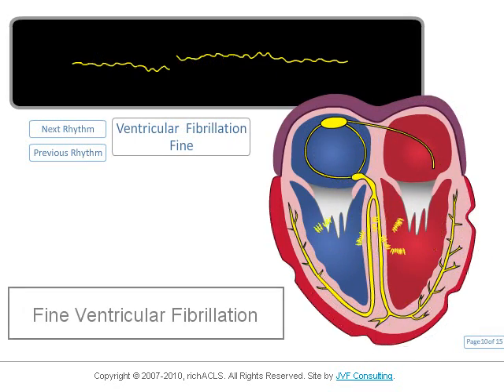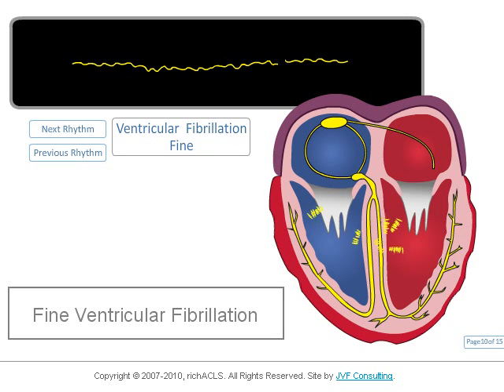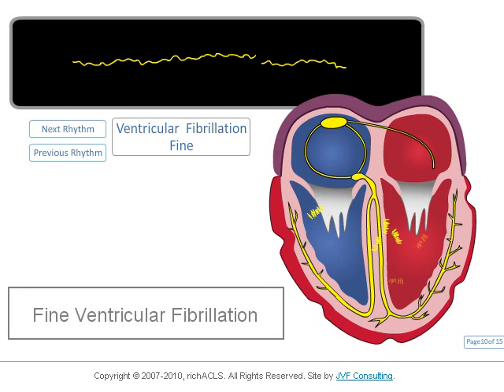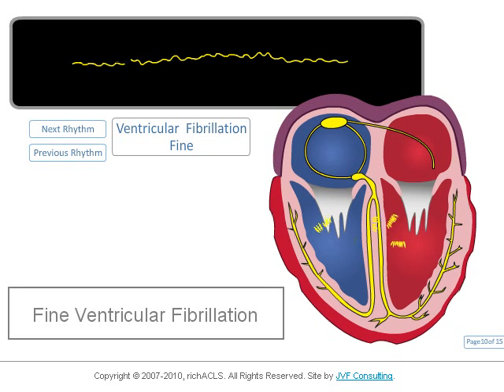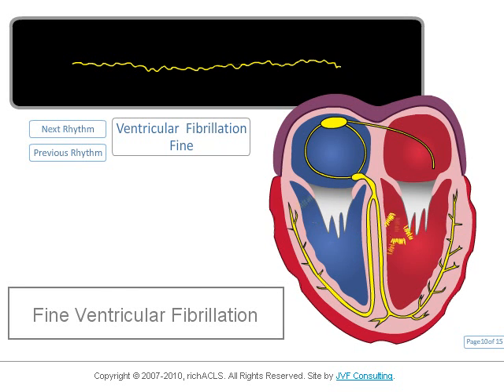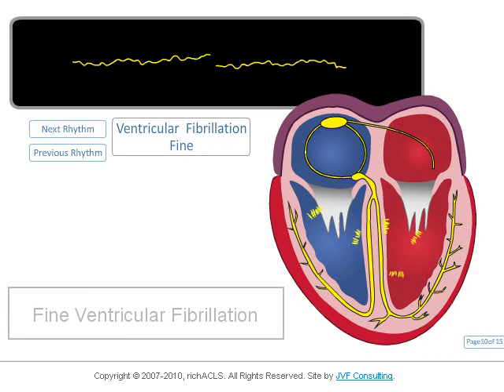Here is fine ventricular fibrillation. Fine ventricular fibrillation follows coarse ventricular fibrillation as the heart muscle depletes its metabolic stores. The probability for successful defibrillation is significantly less with fine ventricular fibrillation.